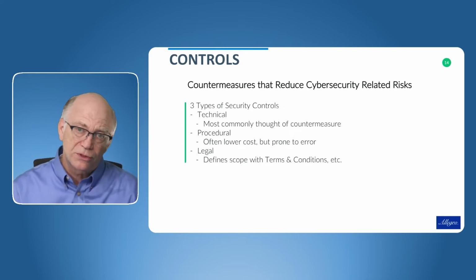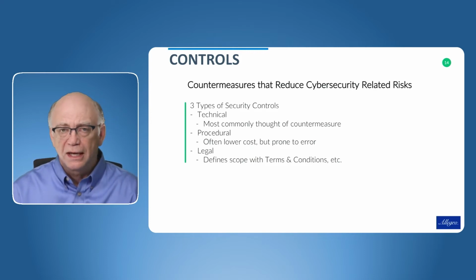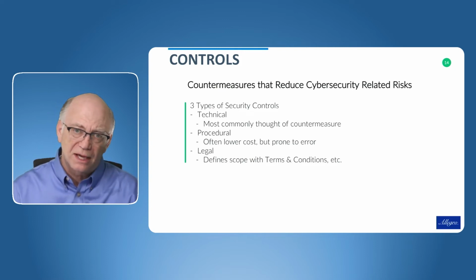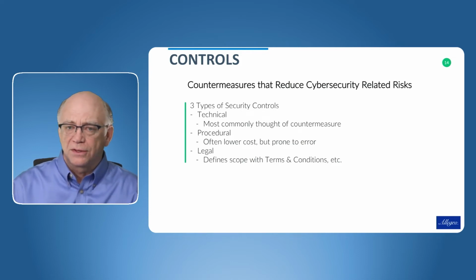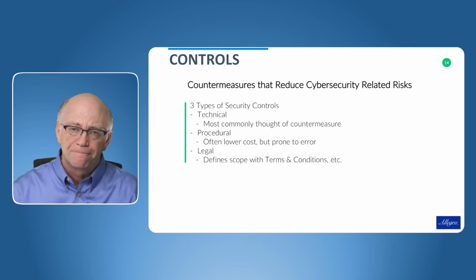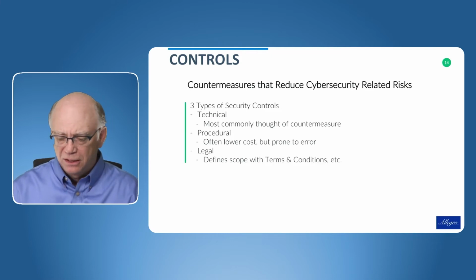There are procedural things that you can do to identify how a medical device is supposed to be used, where it's used, and the environment it's used in, to make sure it's used properly. The last one is a legal aspect for the product itself. The legal documents specify how the product is used, where it's used, and what legal domain this product is in, to make sure that everything is safe.